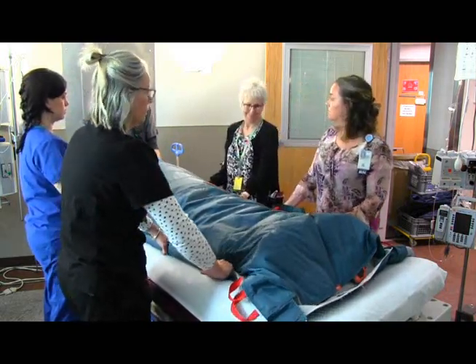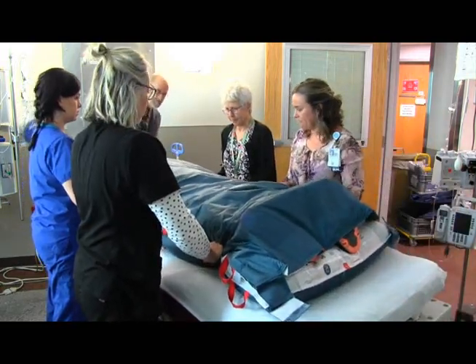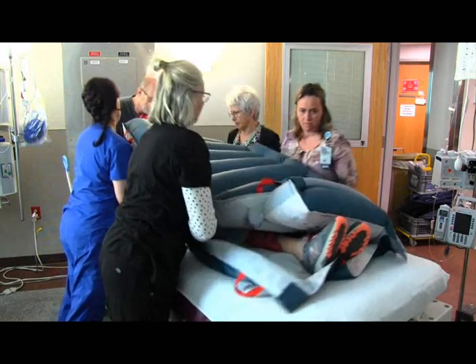Once the mat is fully inflated, the patient is positioned toward the senders. Senders raise with palms up while receivers grab both mats and push down and forward to position the patient in the supine position.